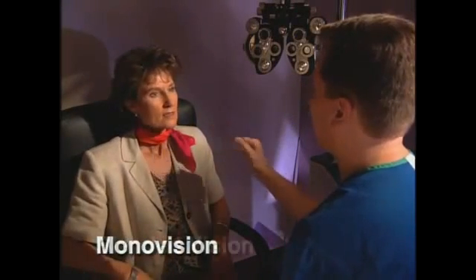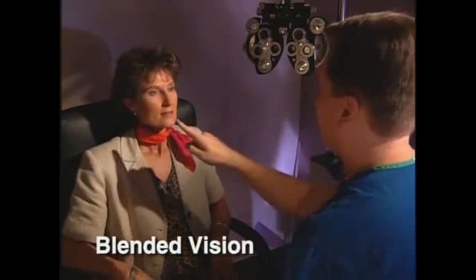If you're approaching or over the age of 40, you may want to discuss having monovision or blended vision with your doctor. This is where one eye is corrected for near vision and the other eye is corrected for distance.